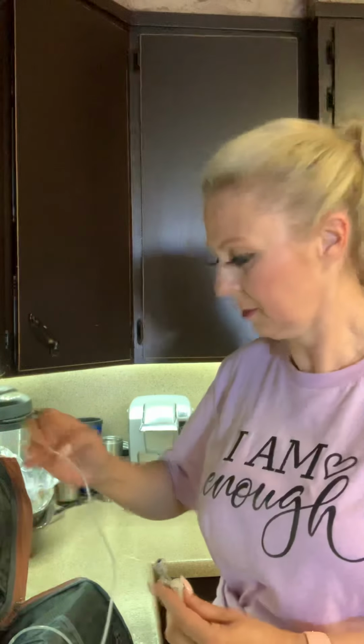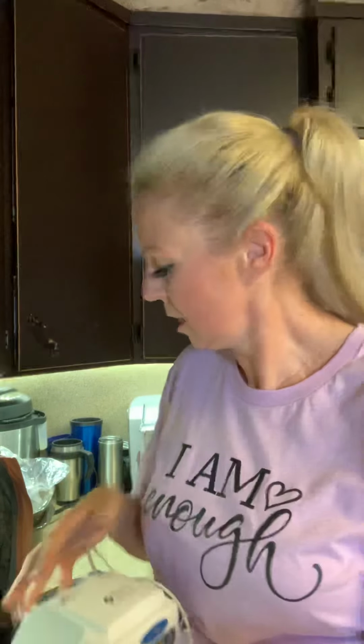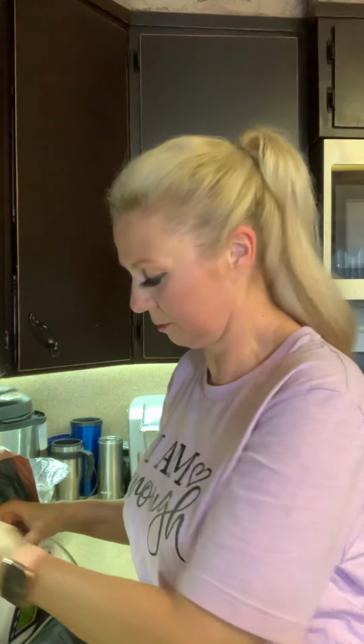I can drink water, but as funny as it sounds, I choke on water, liquids, pretty much everything. And then I attach my feeding tube. And then I push run. So this is my pump. This is 27 right here, and I'm supposed to be at 95. So over a course of 4 weeks, I'm only at 27 mLs an hour. So like I said, I have quite a ways to go.